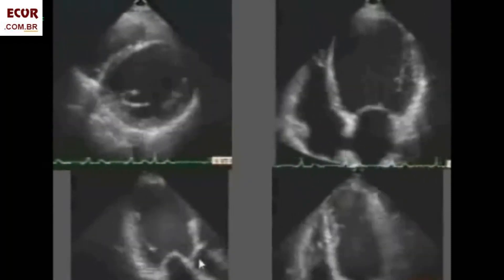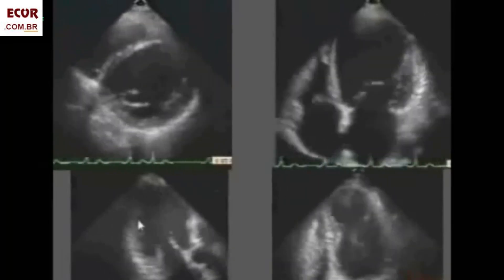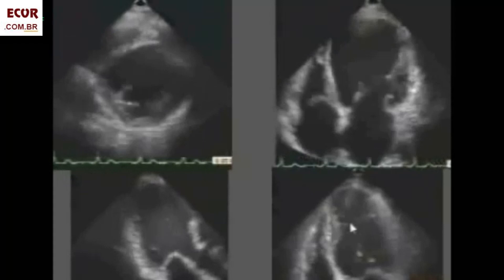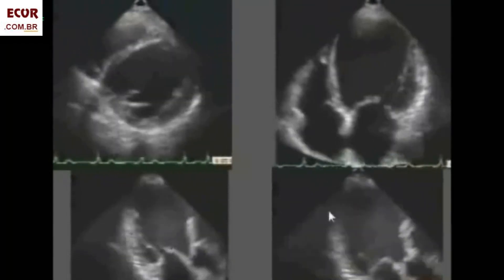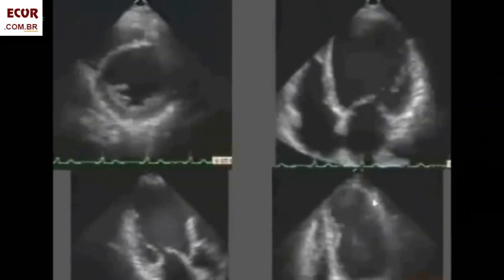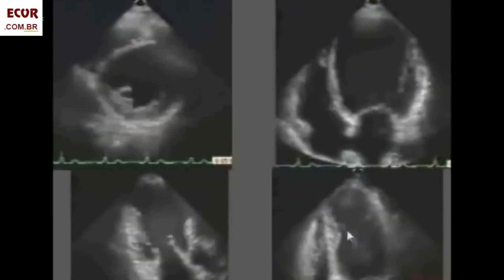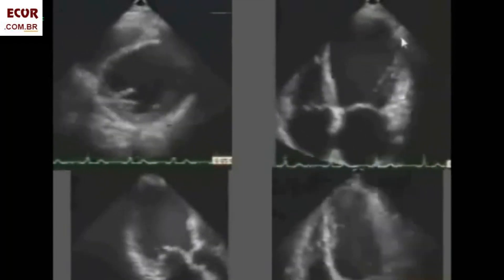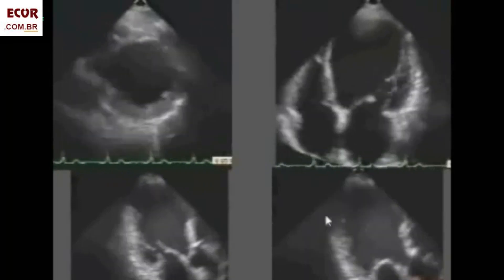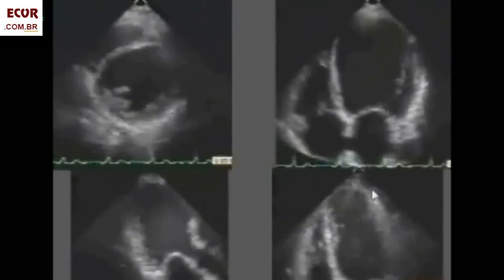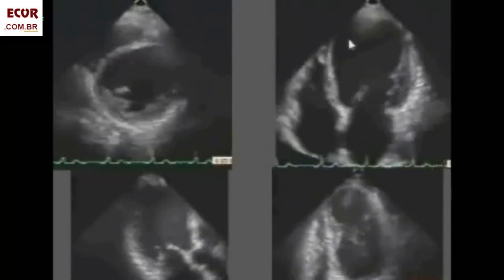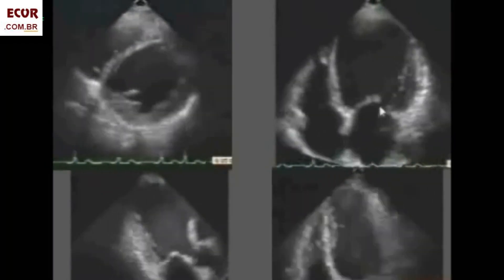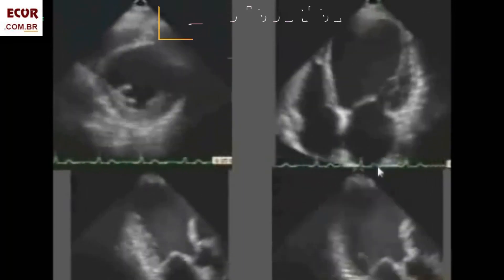In this long axis apical view, we can really see what seems to be a neck of the aneurysm — it looks like this wall here gets thinner. But in this apical four-chamber and long axis view, we see here a perfect neck — from here to here. See how it gets thinner over there. And the aneurysm here is much smaller than it seems in the other view. You do have to look in several views. The reason it looks bigger in one view is because we don't see the neck there, so we don't know where the aneurysm starts. When you see the neck, you're sure where it starts and then you are sure about its size.